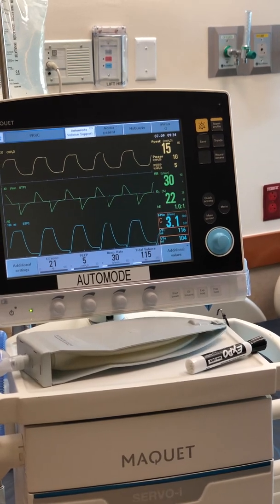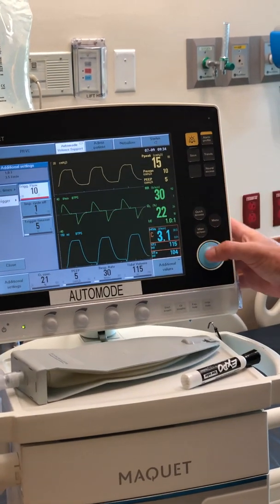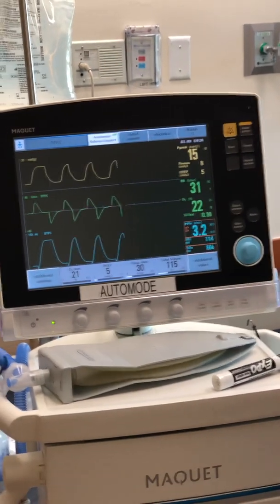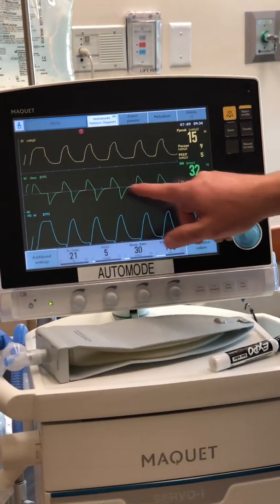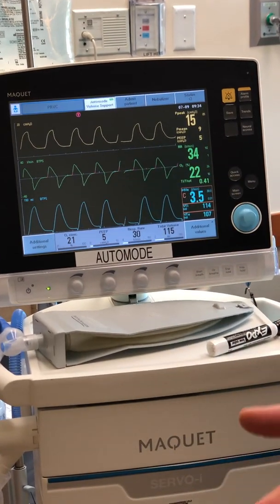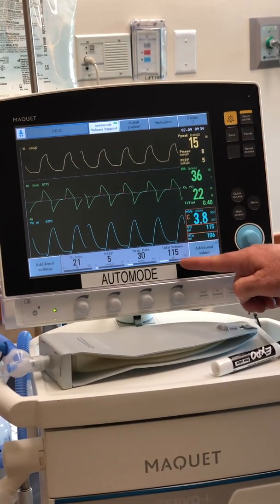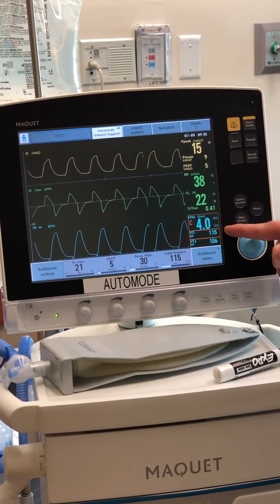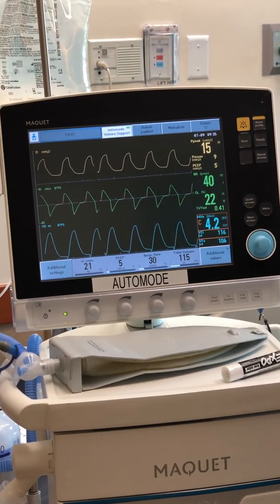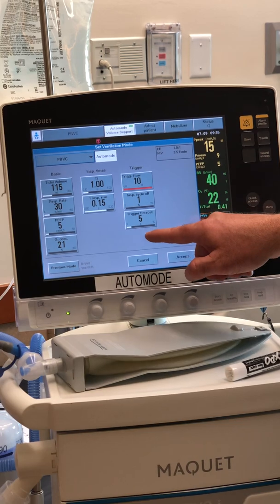Now I'm going to set it so the vent auto-cycles to simulate the patient taking a spontaneous breath. You can see a pink spike — in real life this means the patient started breathing spontaneously. Now I'm in volume support, kicked over away from the rate of 30. It's essentially CPAP with pressure support, and the vent will increase the pressure support until 115 cc is delivered on the inspiratory limb — letting the patient control their own rate.